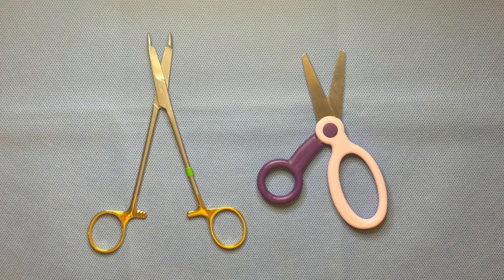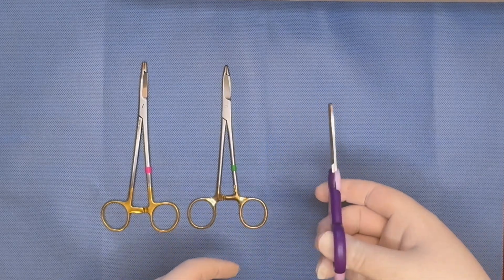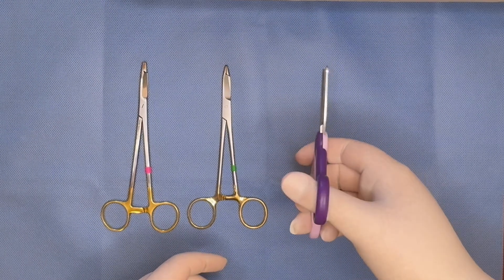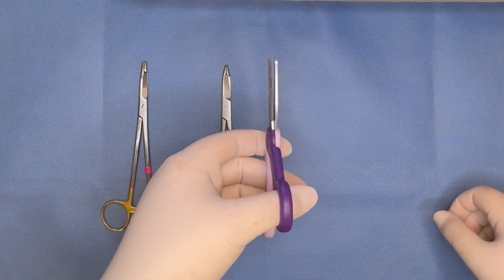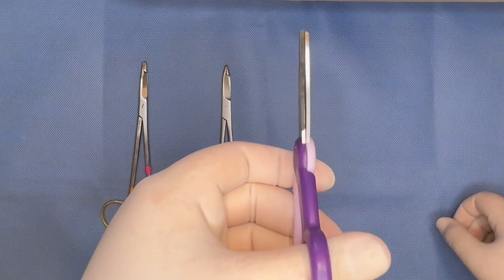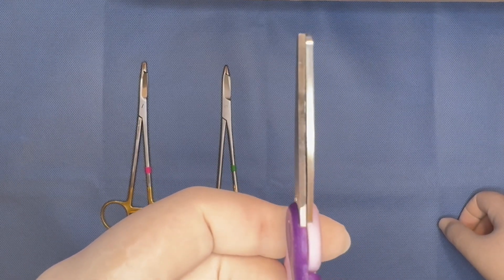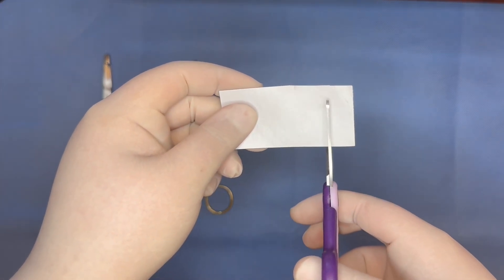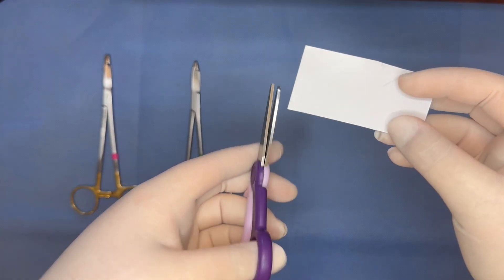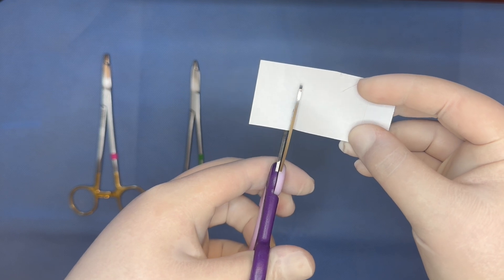Moving on to scissors, the important mechanical effect to consider is apposition of the blades. The natural gripping motion with the right hand pushes the blades together for a clean cut, while a left-handed grip tends to push the blades apart. Using standard or right-handed scissors with a left-handed grip has a similar effect to using dull scissors, with reduced shear and torque forces resulting in decreased precision and increased tissue trauma. My fellow lefties likely remember the grade school experience of trying to use safety craft scissors that manage to bend or tear the paper more often than they actually cut.